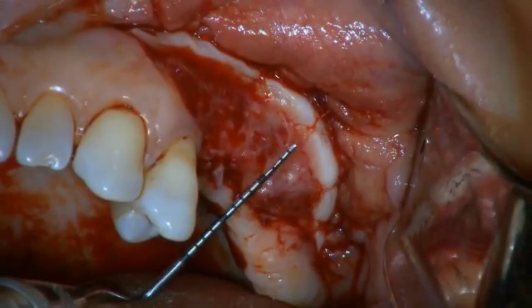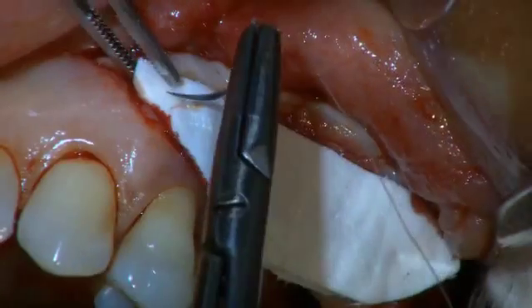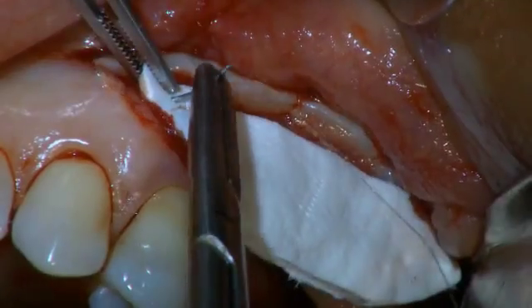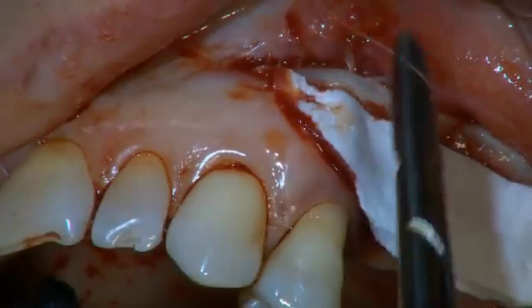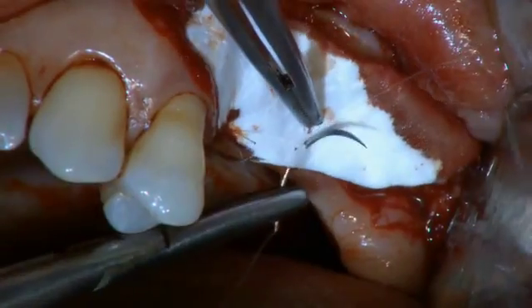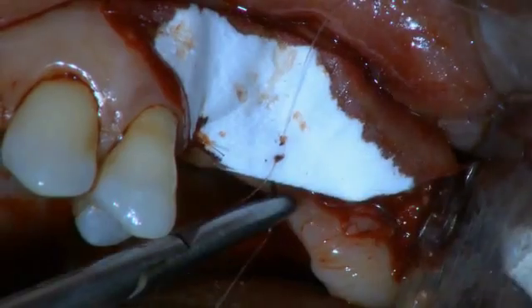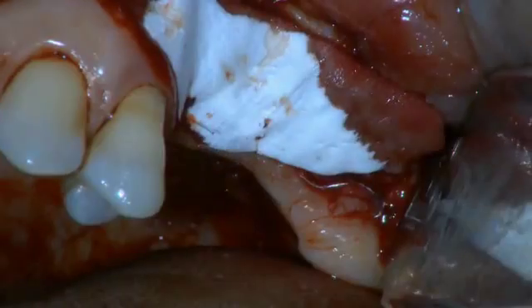Now, a Geistlich Mucograft, trimmed to fit the defect, is sutured onto the periosteal bed, adjacent to the strip gingival autograft, with 6.0 sutures. This direct contact is important to allow transfer of keratinized cell signals from the autograft into the collagen matrix.